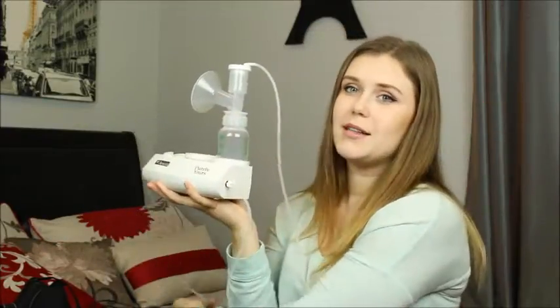Because you do have two of these, you can connect both bottles at the same time and pump both breasts at the same time. I found it more comfortable to do one at a time, just because you do sit there for a while and it kind of gets boring. So I usually had a Sudoku puzzle, a book, my phone, something next to me. So as I'm pumping with one hand, the other one is busy turning pages, writing numbers into my Sudoku puzzles, something. I had to pass the time somehow. But this is what my setup looked like, pretty much.